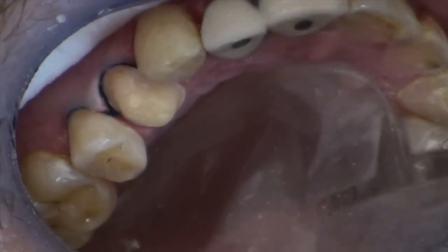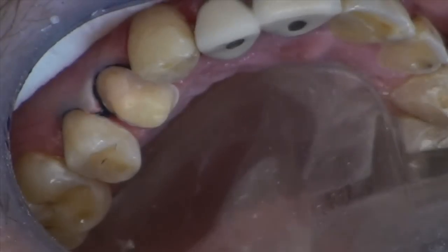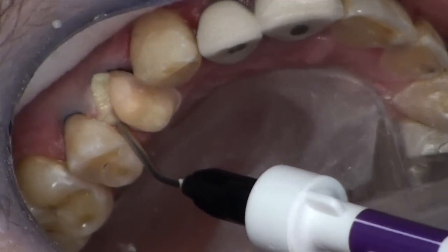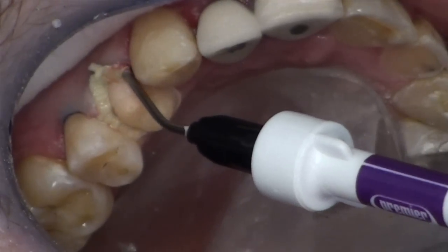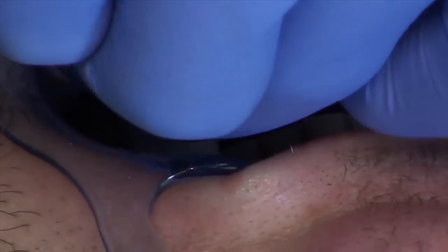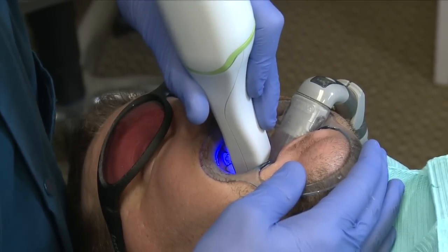Now that our preparation geometry is finalized, we need to focus on tissue control. A little bit of time spent here will pay huge dividends in the quality of our impression. We've already placed some retraction cord; now we're going to place some Traxodent hemostatic paste to effectively retract that tissue. We simply inject this around the marginal areas and then have the patient close on the preparation and the paste with a compression cap for a couple of minutes. Once that's done, we'll rinse it all off, and you'll be able to see how clearly that margin is visible in the impression. So now let's go ahead and get our optical impression and take a look at the quality of our virtual model.